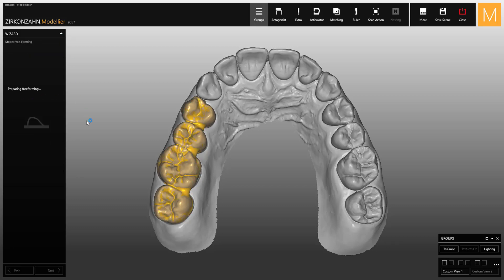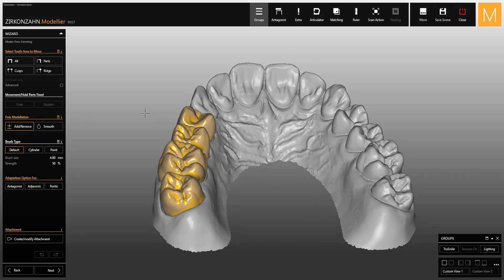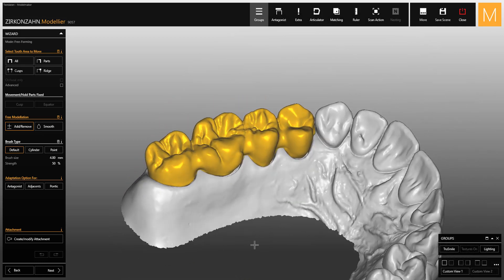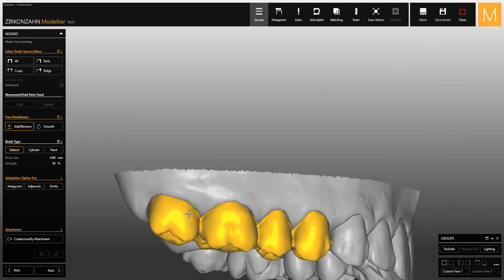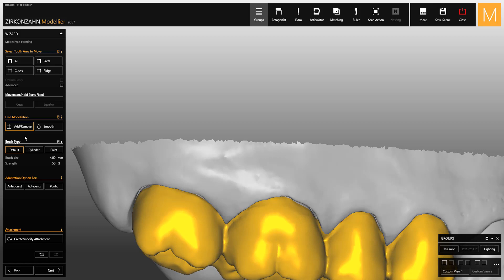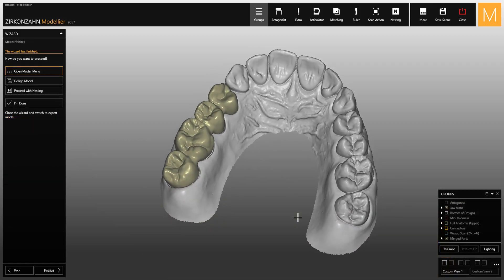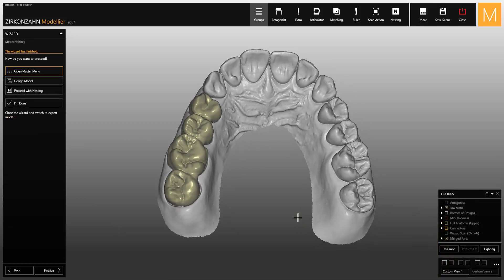At this point the software performs a calculation in which the new wax-up is generated and adapted to the preparation margins. Changes to the new structure can then be made using the freeform tool. By clicking Next, the design is merged and ready for nesting.